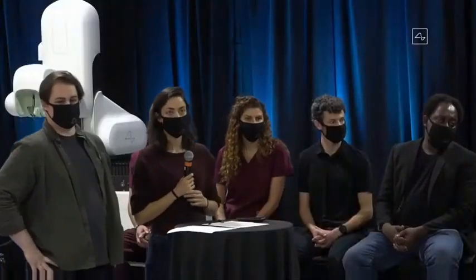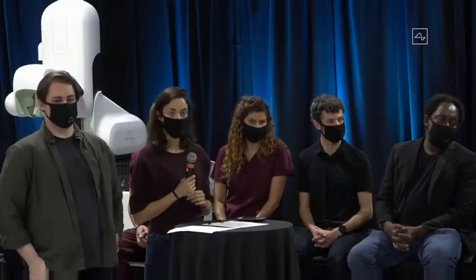Awesome. Ian, did you have anything to add? The robot is designed, like the full length is 7 or 8 centimeters. Right now we're designed for about 6 millimeters. The actuator itself isn't actually limited to 6 millimeters. It can go much deeper. In addition to scaling out to the rest of the surgery, we're also scaling to deeper, which is mostly a sensing problem. The ability to avoid deep vasculature is an interesting problem that we're working on in the robotics world here. So yeah, lots of cool problems in the robot.